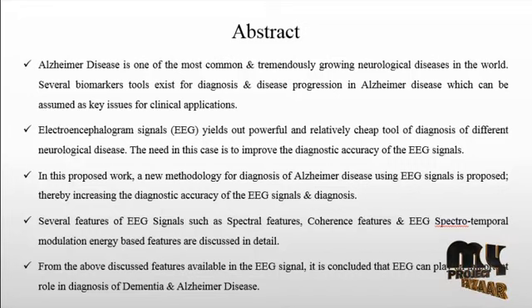Derivatives of the EEG technique include evoked potentials, which involve averaging the EEG activity time-locked to the presentation of a stimulus of some sort, such as visual, somatosensory, or auditory.